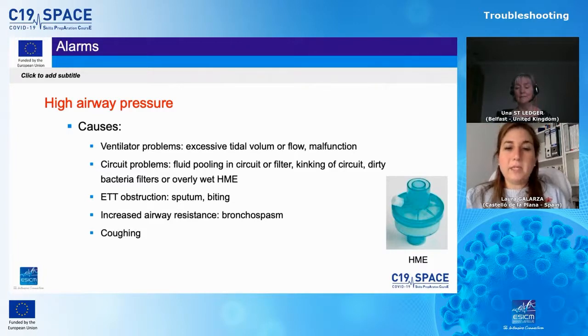Maybe the patient is coughing because of some secretions, the patient is agitated, or even has some patient-ventilator dyssynchrony, or as we sometimes call it, the patient is fighting the ventilator. In these cases, we should look for the cause of this dyssynchrony and try to solve it, or sedate our patient a little bit more heavily.